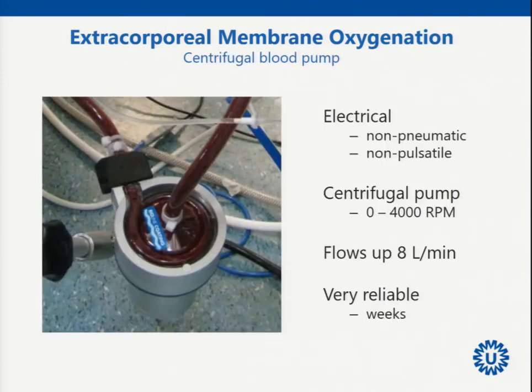So this is the clinical situation of another centrifugal pump. This is the Maquet system, the former PLS system. So it's driven electrically, so non-pneumatic, and it's non-pulsatile, so it provides a continuous flow. The centrifugal pump, that depends on the design. If the pump is smaller, the revolutions per minute will be higher, and that depends, of course, on the flow that you would like to achieve.